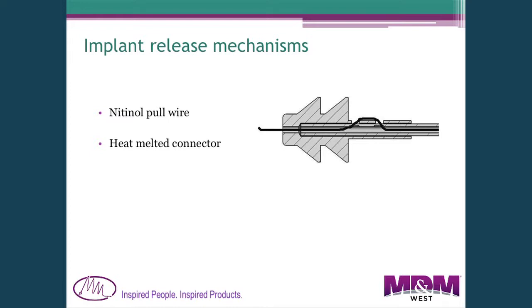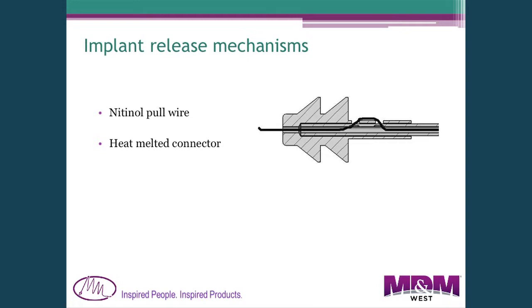Finally, here's an example of a release mechanism we've used in several products. It uses a release wire threaded through a hole in the catheter and then through the device to be delivered — in this case a Christmas-tree-shaped part. This wire holds everything together during positioning. Once you extract the wire out the back, it pulls out of those holes and releases the device completely. It's a very simple and reliable way to hold and then release a device.